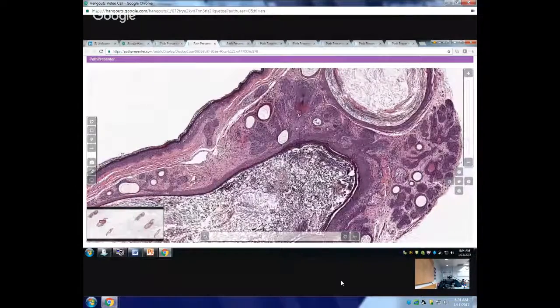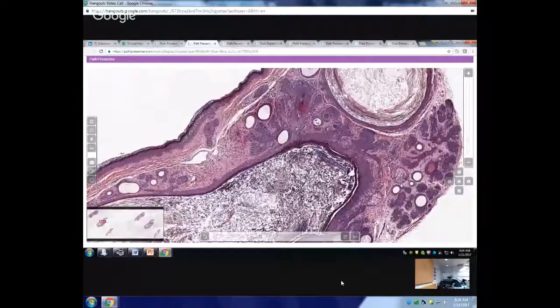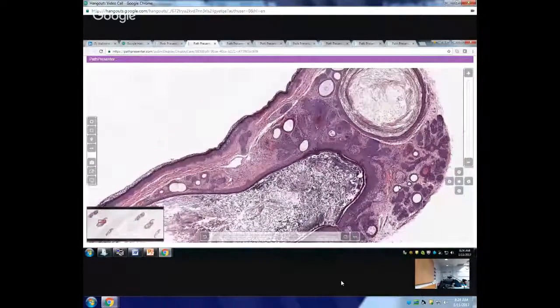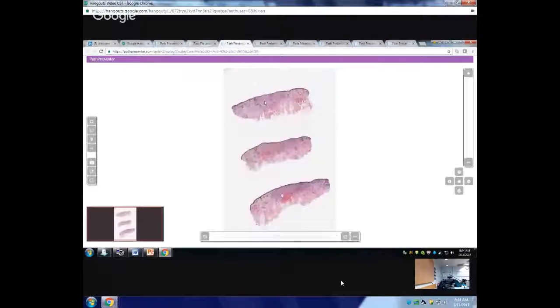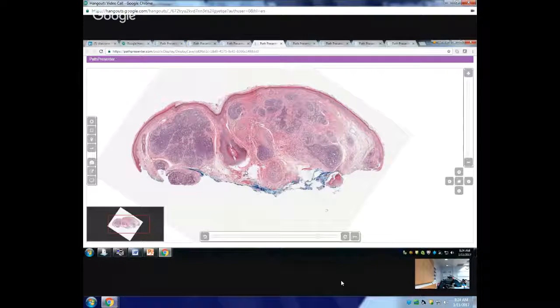The only thing it is telling you is trichoepithelioma, because that is the only hair follicle neoplasm that can look like this. But when it becomes very desmoplastic, then you call it a desmoplastic trichoepithelioma. And when it is very classic like this, and they all look very classic like this, if you pull out 15 cases of trichoepithelioma, 10 are going to look like this. So you just have to make a picture in your brain that this is how it's going to look.